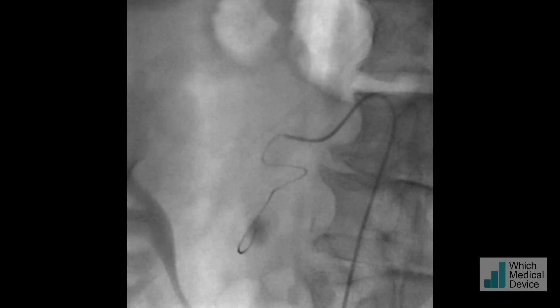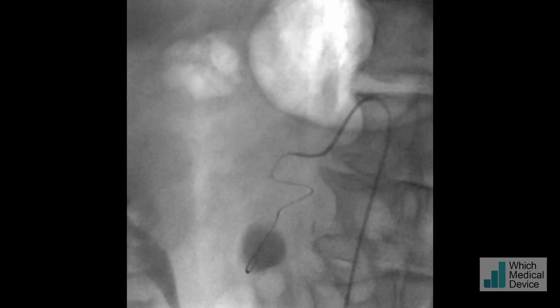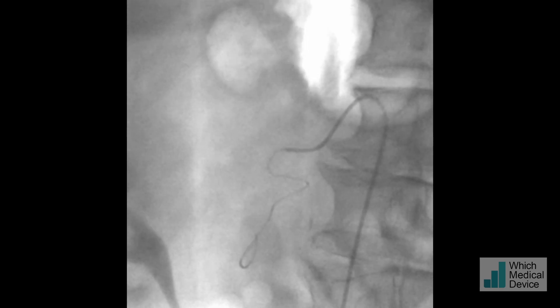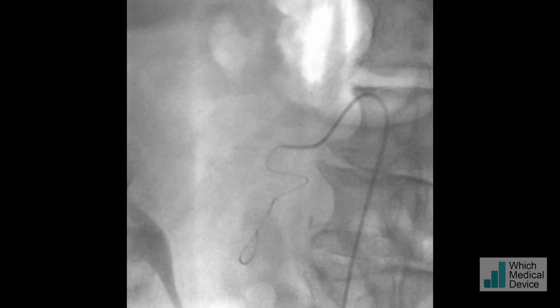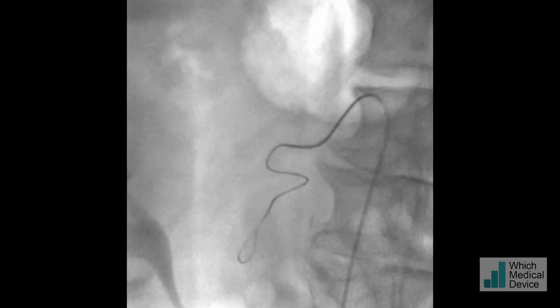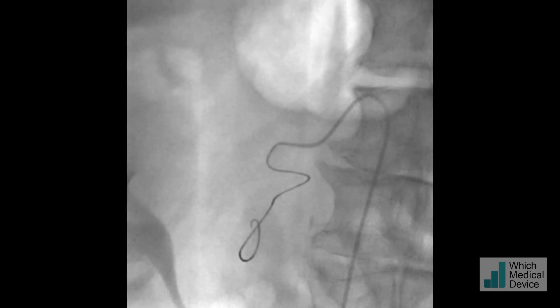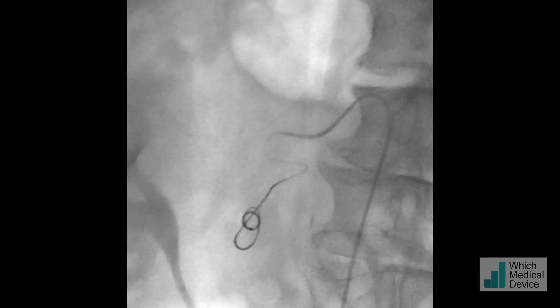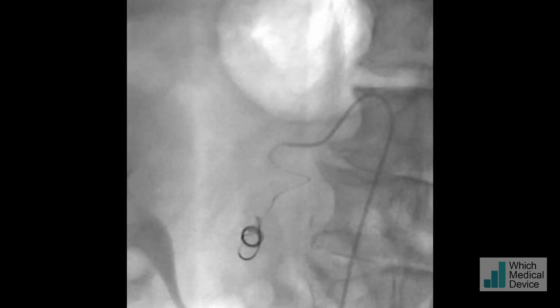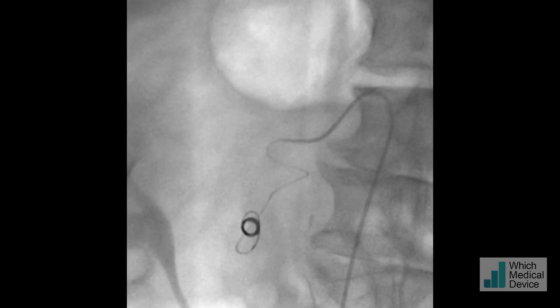More by luck than good management, I've got my microcatheter into the pseudoaneurysm cavity, injecting contrast, and you can see the relatively slow flow within this as the neck is pretty much occluded by the microcatheter. I then placed a micro spiral coil into the pseudoaneurysm and planned initially to fill it with these microcoils — this is a 14-centimetre one — but it was rapidly apparent that this was going to take an awful lot of coils, so I then decided to use glubran.